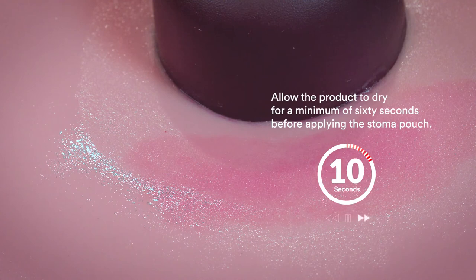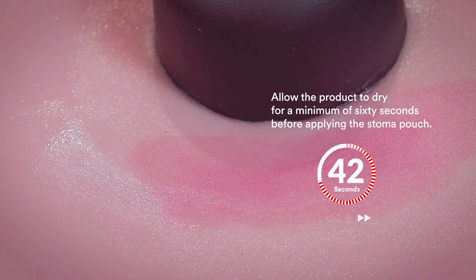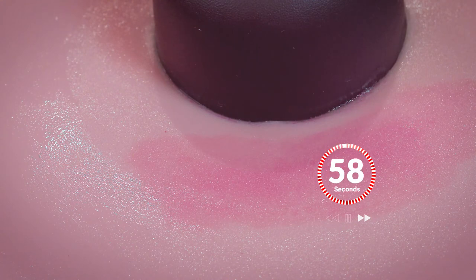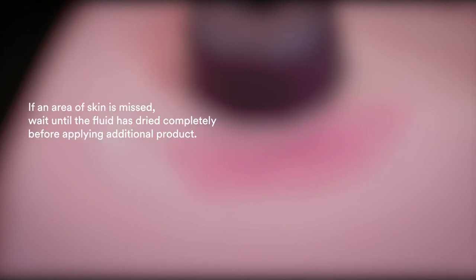Allow the product to dry for a minimum of 60 seconds before applying the stoma pouch. If an area of skin is missed, wait until the fluid has dried completely before applying additional products.